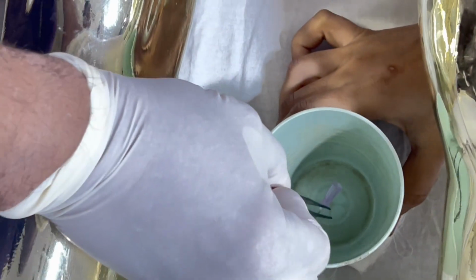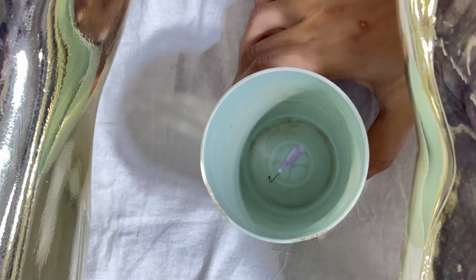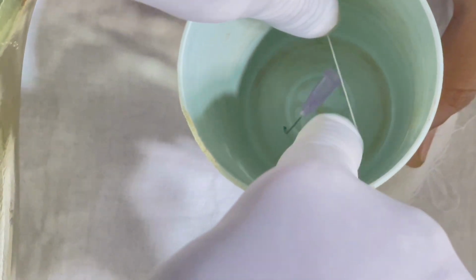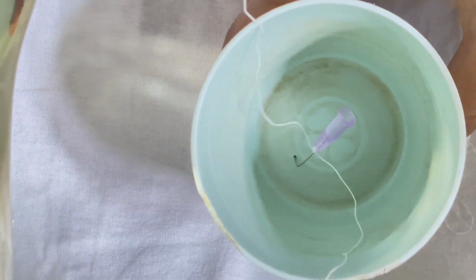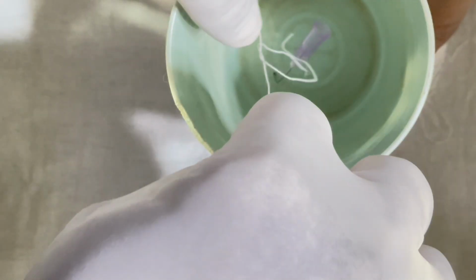You can see there is a hook, and this hook is very easily retractable, and I have to put this suture by the hands, by the hand around the hook or by the instrument. So I just cover this in this manner, and then without giving traction on that, I have to make a knot over that.